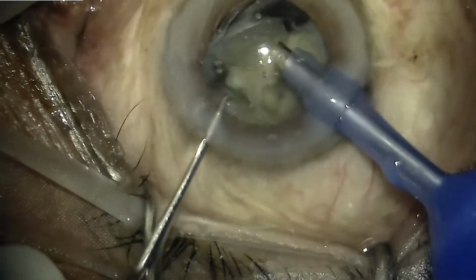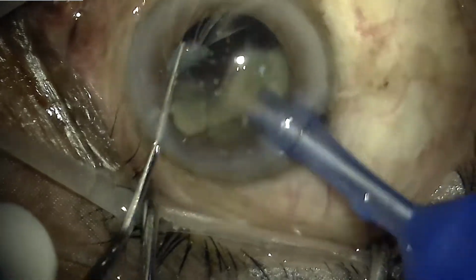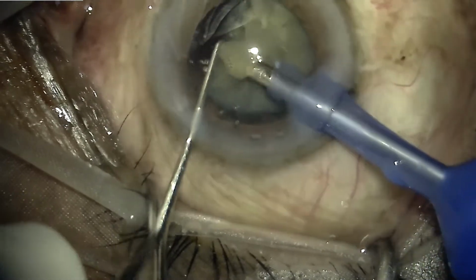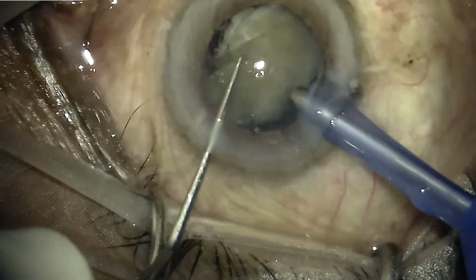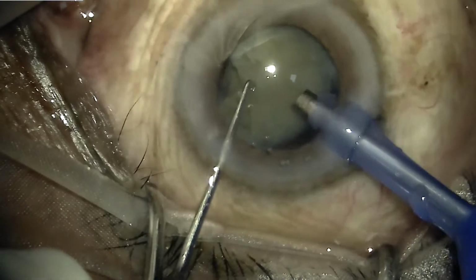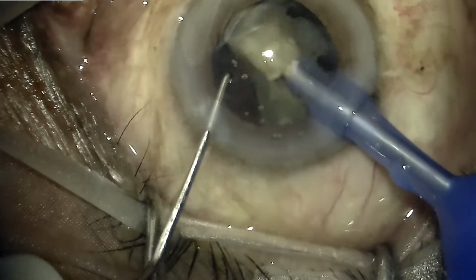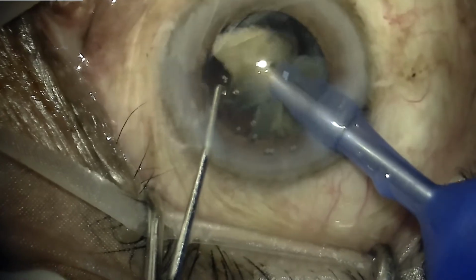Now, this is a phacoemulsification surgery. It was a pretty hard mature cataract, and we are happily chomping away the nucleus, which is bulky, occupying nearly most of the bag. And here we have half of the nucleus bisected and consumed using phaco power.